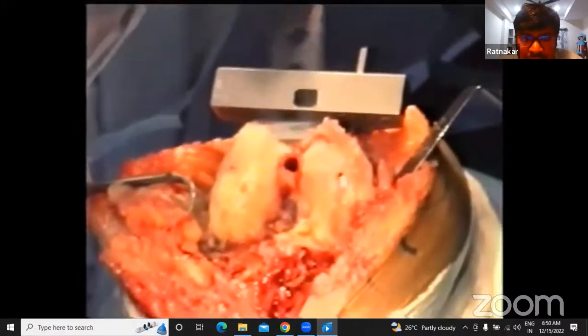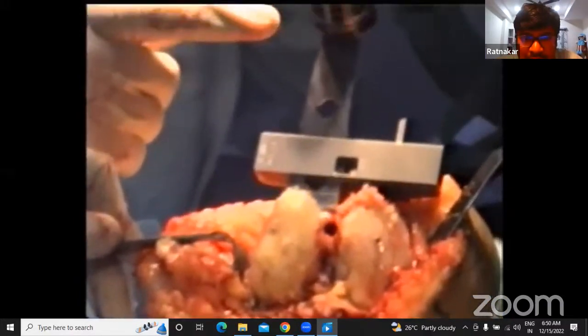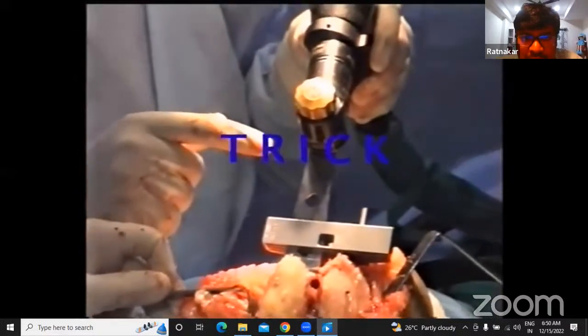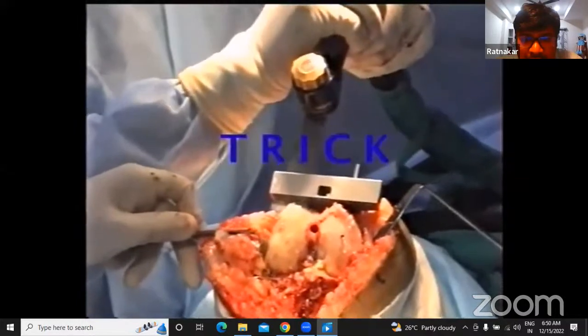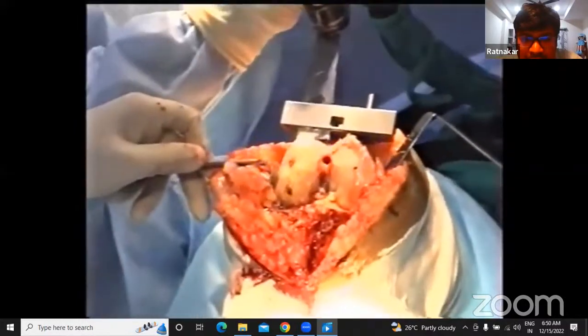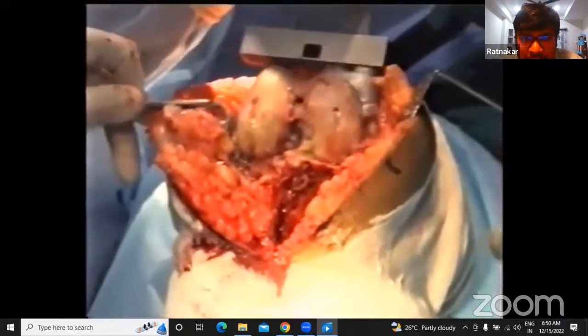When you do the cut, you should always try to cut both condyles in a single stroke, but never cut one first and one afterwards. Then there will be the stem.